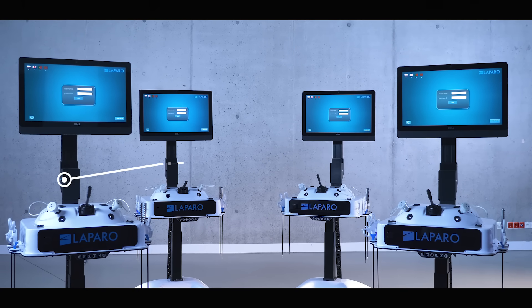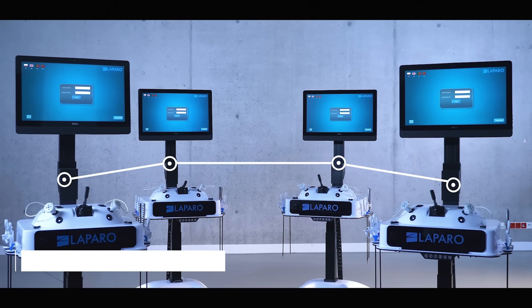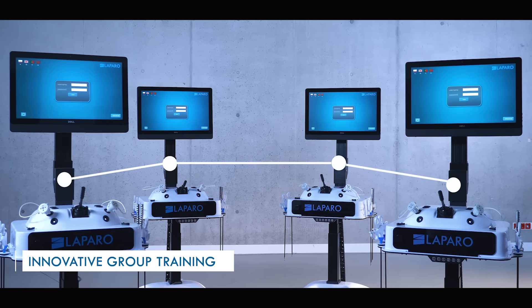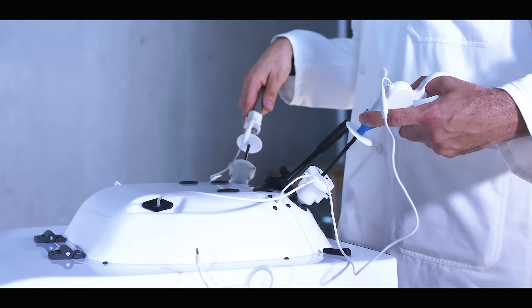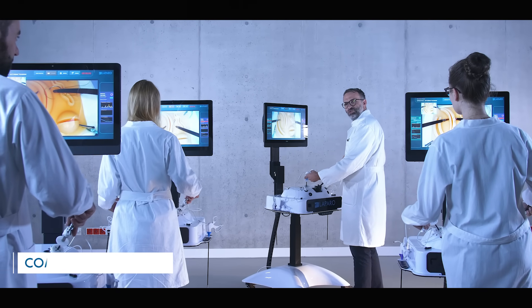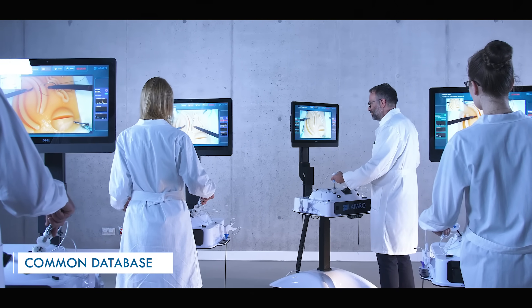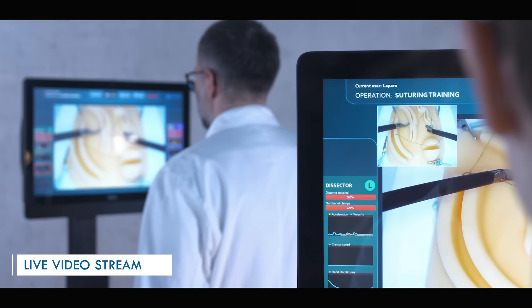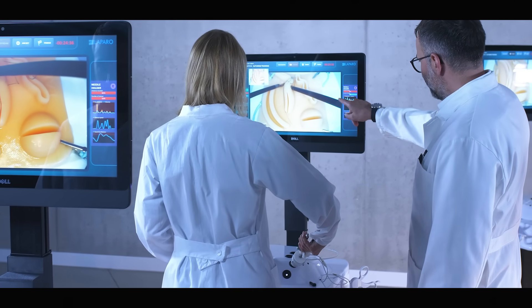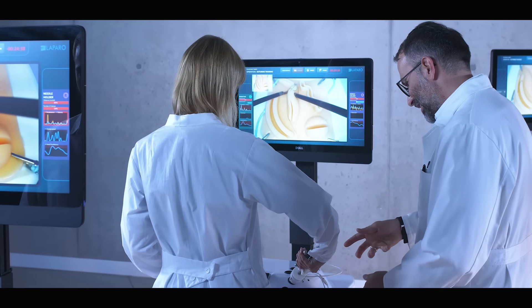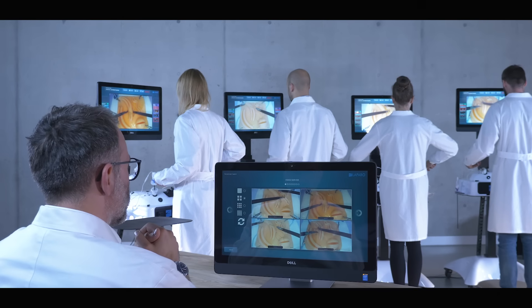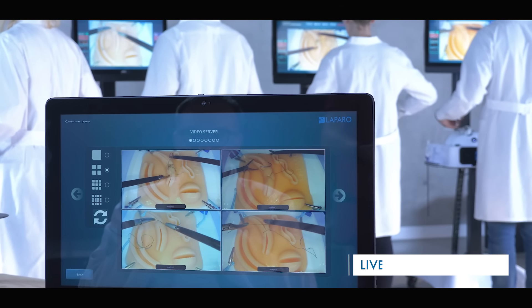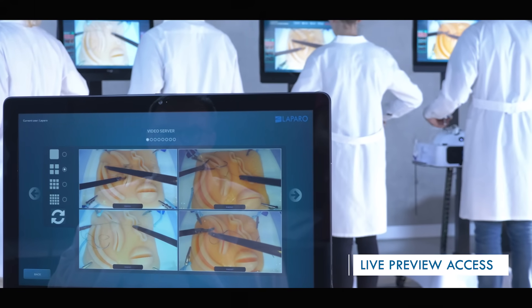LaparoAnalytic devices can be connected into one network, introducing innovative functionality to group training sessions. The system uses a common database, so users will have access to their accounts at each station. The instructor can stream their own preview from the laparoscopic camera to students' devices, allowing the whole group to follow the instructor and perform training step-by-step. The instructor also has live access to the previews from all stations, which significantly improves workshop quality.